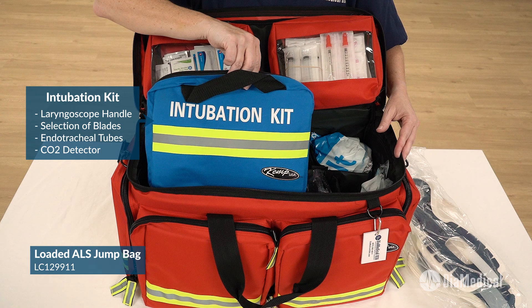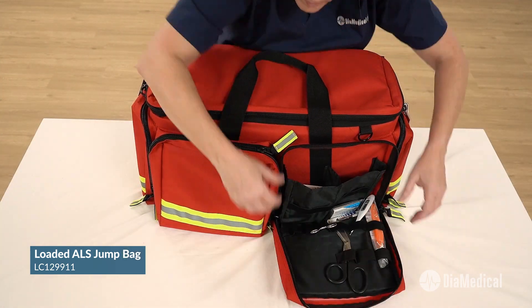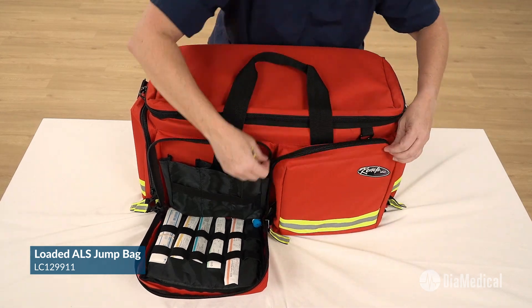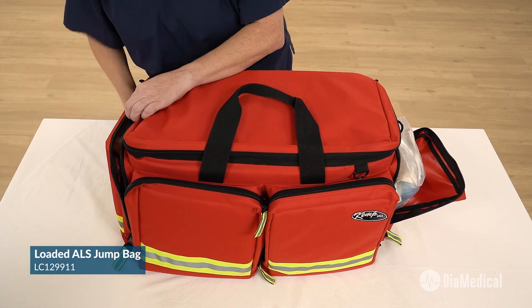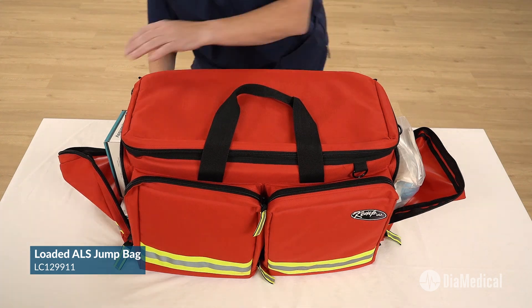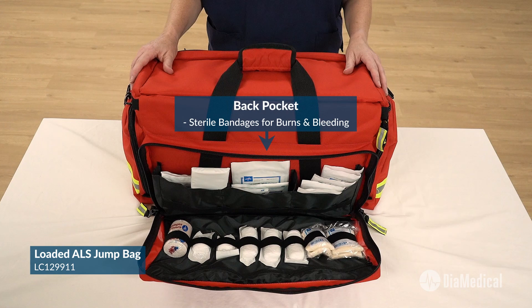It features a laryngoscope handle, selection of blades, and endotracheal tubes with a CO2 detector. The front pockets contain EMS pocket tools and all types of IV supplies. The side pockets hold a glucometer with strips and lancets, as well as an OB kit for pre-hospital childbirth training. The back pocket contains sterile bandages for burns and bleeding wounds.